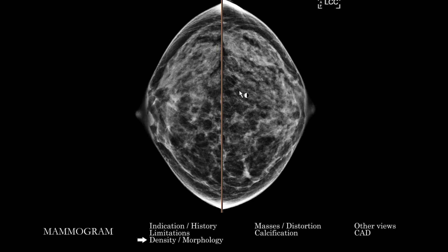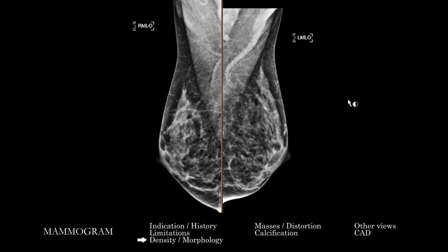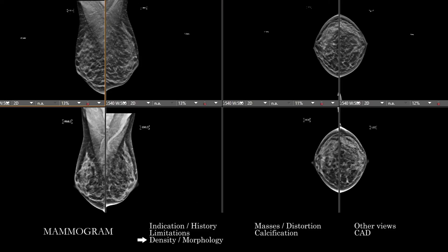It can be useful to know the context of what was previously described and changes over time. As we look at the MLO and CC, you want to get a sense of overall symmetry and if there has been a change in the overall density or appearance of the breast compared to prior — the prior is up here and the current is down here. It's good practice to go back at least two years, as changes can be subtle with shorter intervals.